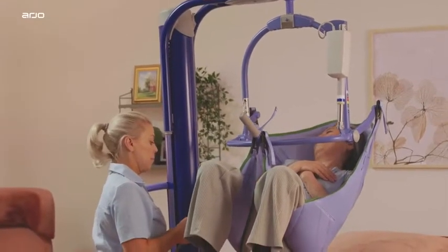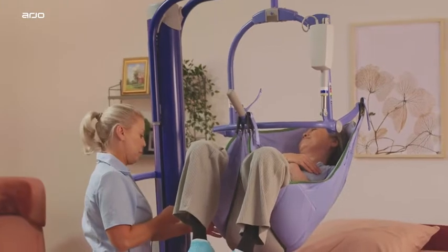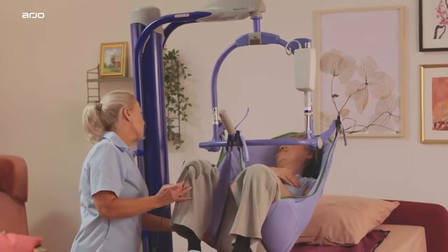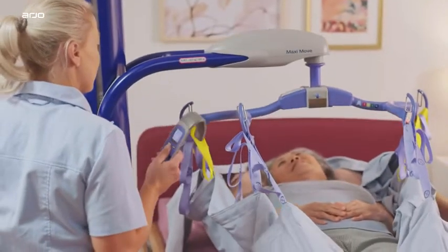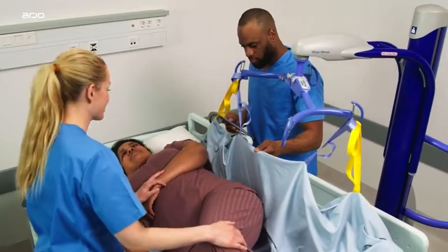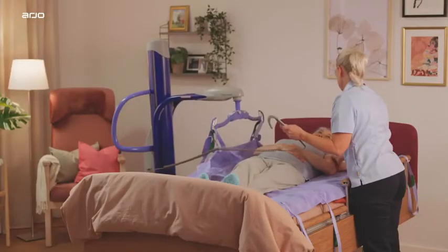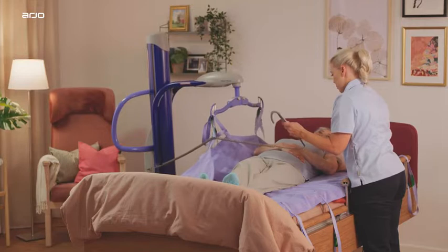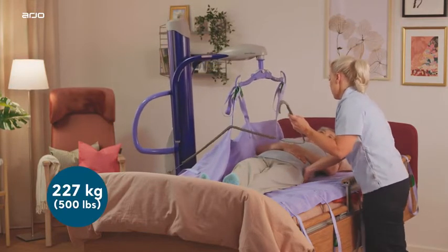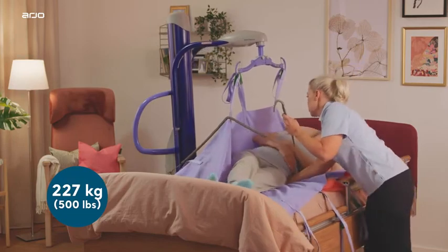MaxiMove is a multi-function lifting device, a versatile solution that can be adapted using a variety of spreader bars to accommodate diverse patient transfer and mobility needs. Arjo's MaxiMove is suitable for use in acute and long-term care for patients and residents with a mobility level of Doris or Emma, weighing up to 227 kilos.